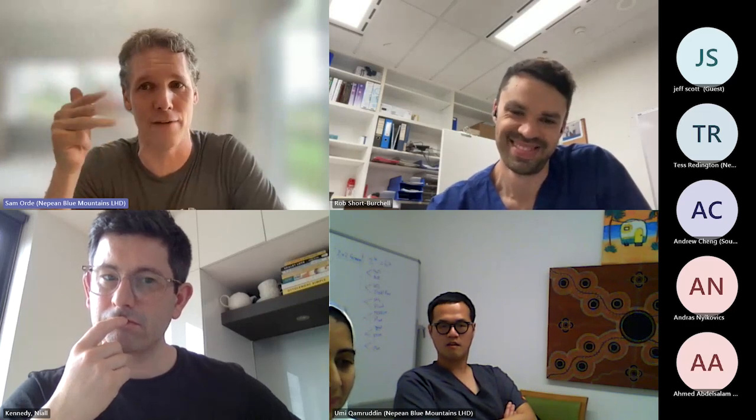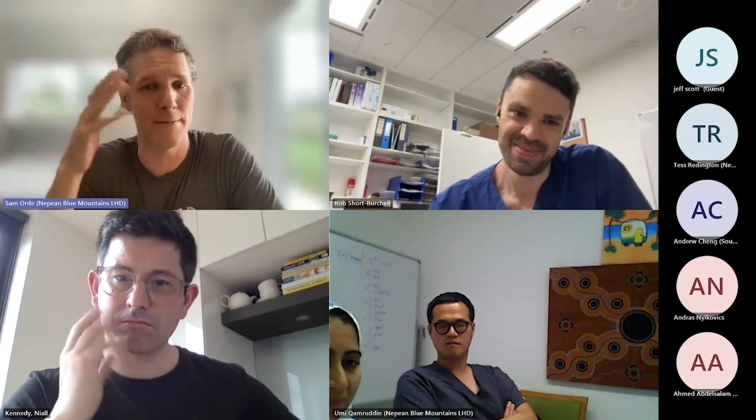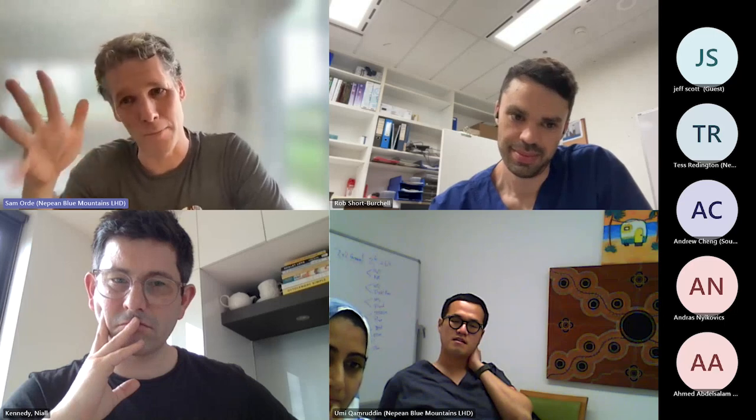no mitral annular calcification, no bundle branch block, they're not tachycardic, they're not on a significant level of PEEP, and you've got okay images, then you can start to use some of these diastolic dysfunction guidelines. I think as soon as you start to get on PEEPs greater than, let's say, 10 in some of the literature, like in Emma's article, or 15, then some of that E to E prime starts falling away. And I think you've got to start using all the other tools at your disposal.